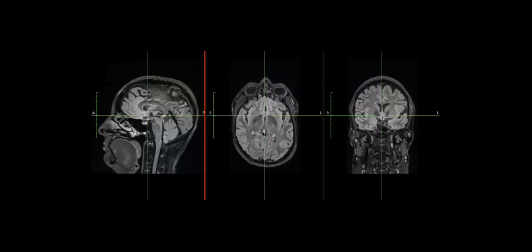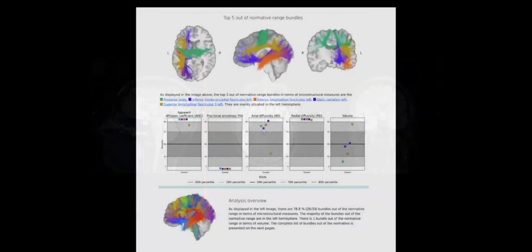This is a different case where there are absolutely no abnormalities whatsoever on the conventional sequences. So this is truly invisible traumatic brain injury. This individual also was in a motor vehicle collision, but there's no structural evidence of it whatsoever. If a radiologist were reading these representative sequences, they might call this completely normal looking.